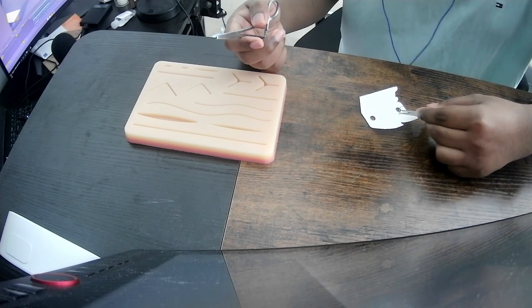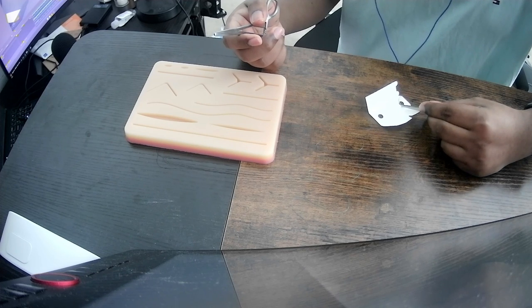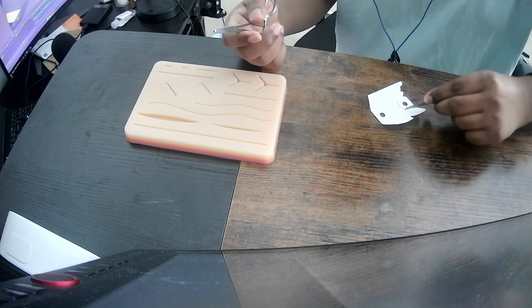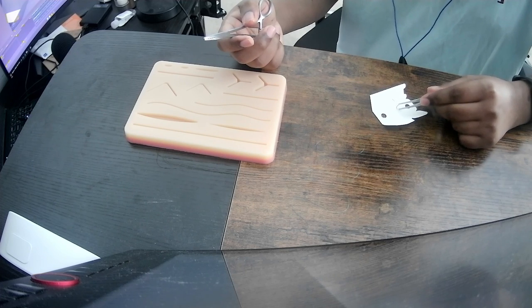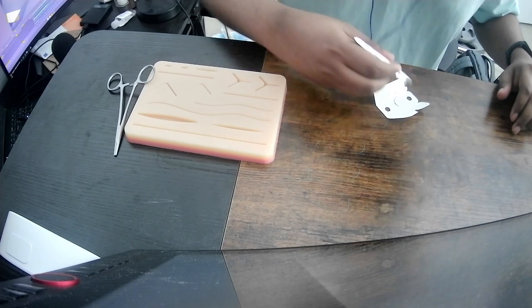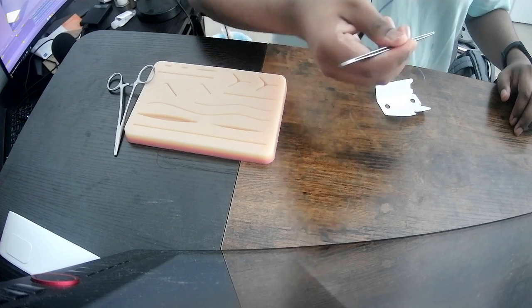Of course, in the operating scenario, everything needs to be sterile, so you can't really grab anything with your hands. Nor would it be wise to just grab a needle with your hand. I was able to do it just a while ago. Is this secure? I don't know. I don't feel like I'm holding it safely. There has to be some better way. Let me try with my right hand. I don't think the dominant hand is the issue. Should I just load it like this?